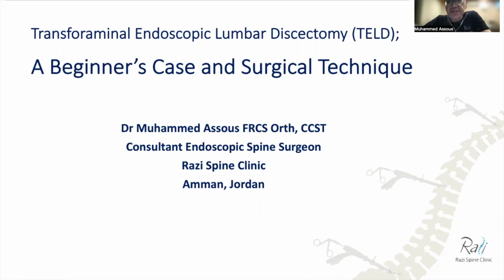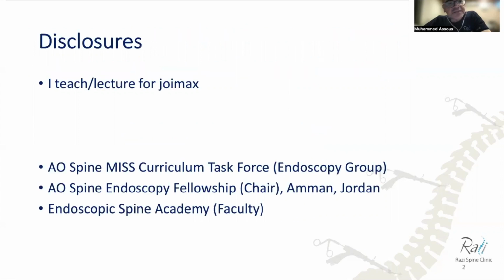So my plan in this presentation is to pick a disc hernia at L4, L5 with certain conditions, which I might call the typical beginner's case, and take you through the surgical technique step by step. Hopefully, this will help you overcome the learning curve when you start this procedure and help you in your endoscopy career. This is my disclosure.